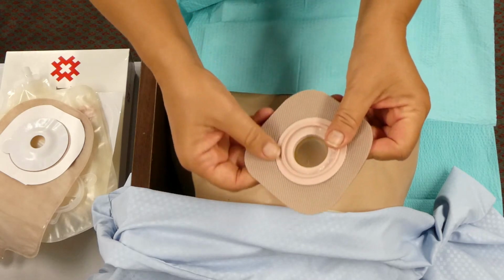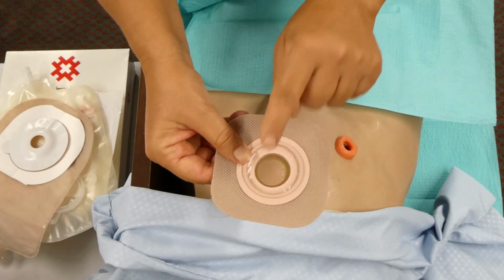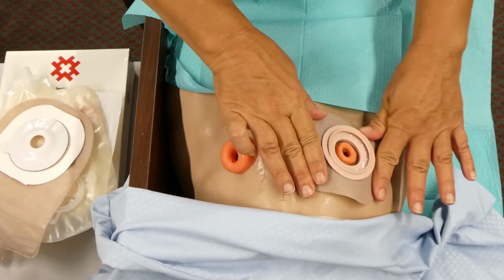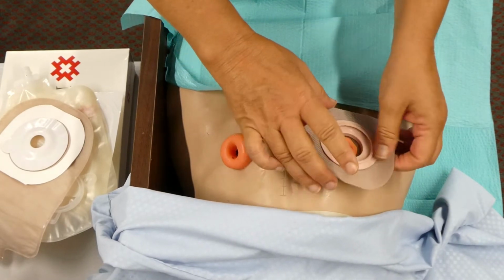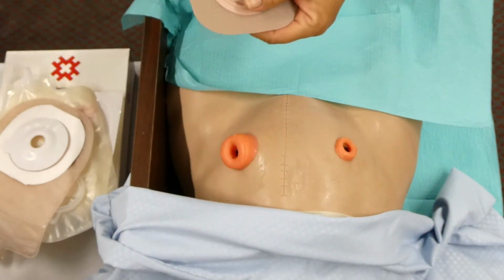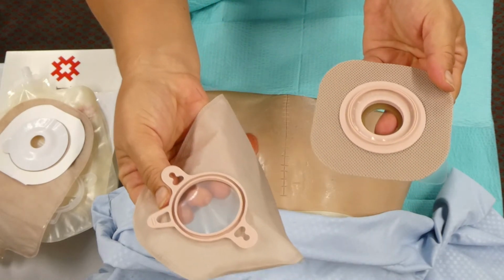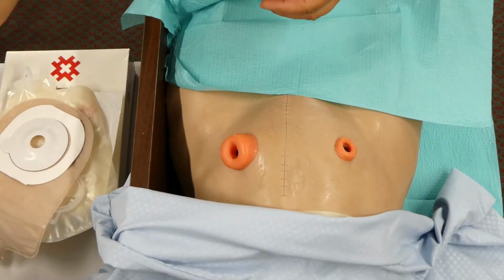Where you can get new ones. Okay, so this would be a pre-measured one where the opening is the size that is ordered for the ostomy. This would fit over nicely here, I think you would agree. And then we would peel that off and really make that fit nicely over that. You can see it almost has like a Tupperware type seal on it. And the bag will seal right to it. Okay, and you can take the bag off and replace the bag as prescribed.